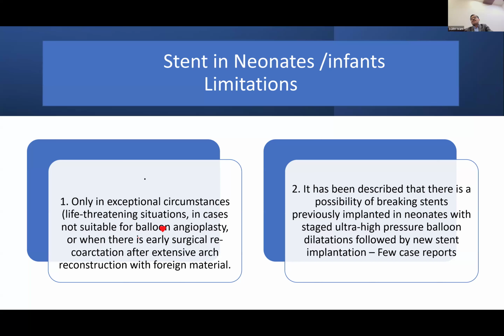A few slides about stents. It's not a topic today, but remember, a stent can be put in exceptional situations where you don't have a backup of a surgeon and you have gone to rupture. So people are trying to have breaking stents or growing stents basically, and you have to understand that. There are a few case reports where people are finding out breaking stents or growing stents.